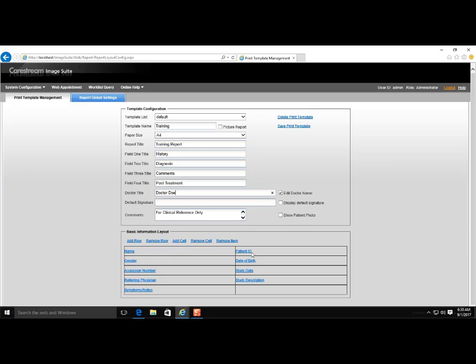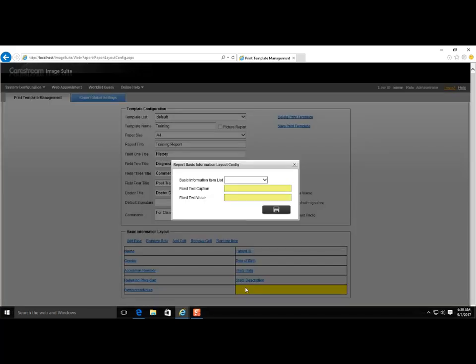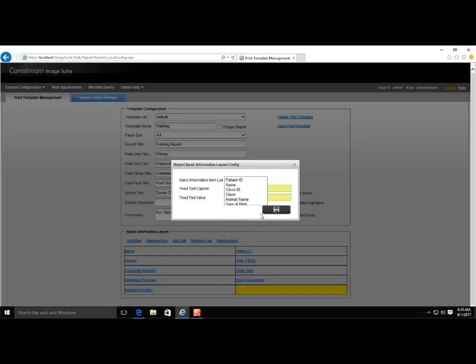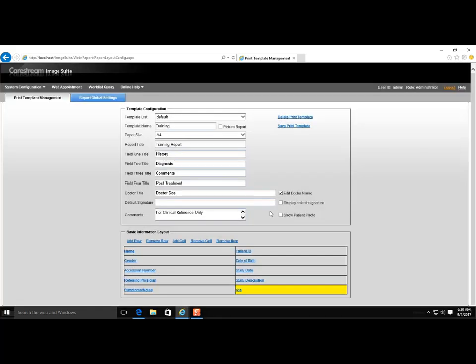Double-click the cell. The Basic Information Layout Configuration box will appear. In the Basic Information list, select the item you wish to add to the new cell. Click Save. After clicking Save, the newly created title will appear in the cell.